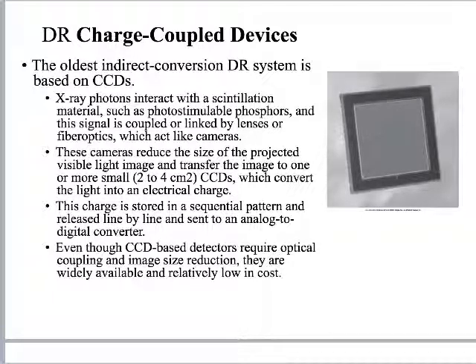Okay, DR charge couple devices. These are the oldest form of DR systems, and they are slightly different from indirect capture. So we will look at them here in a minute with the activity.